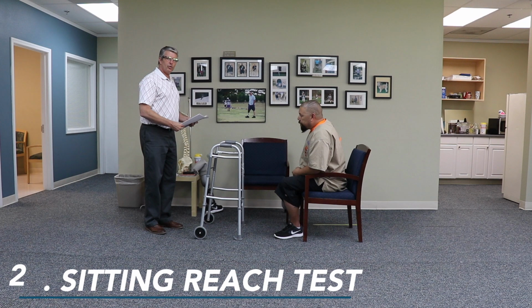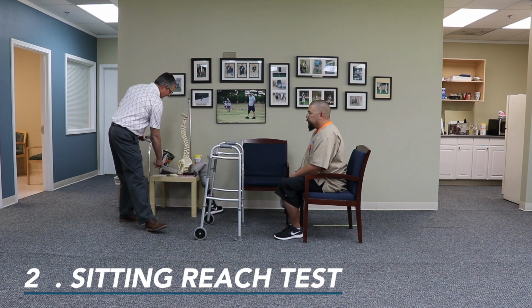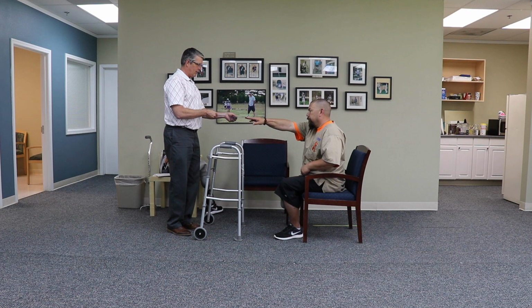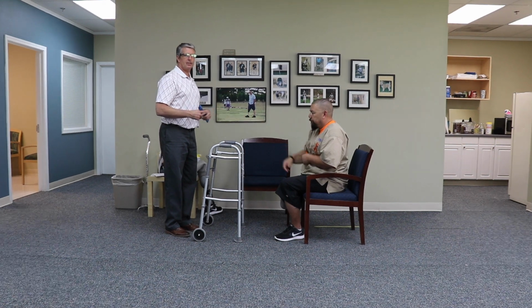All right, number 2 is the sitting reach test of the AMP No Pro test. Okay, so you have a patient sit, reach out with either arm, with the ruler at the end of their fingertips, come up. Okay, Jay was able to accomplish that.